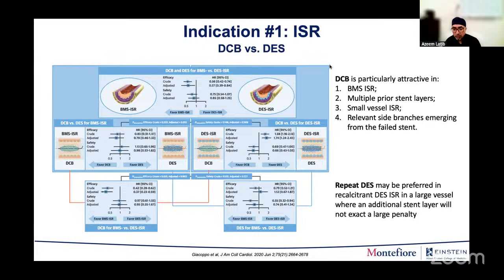But most importantly, what was not taken into the randomization was the angiographic result before putting in another stent versus putting in a balloon. So the patients were in many of these studies, and the most important one is the study called RIBS 5. There was RIBS 1 to 6 done by some friends of ours in Spain.